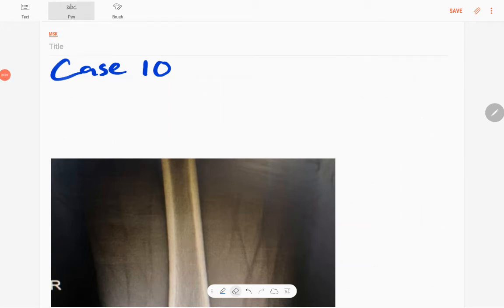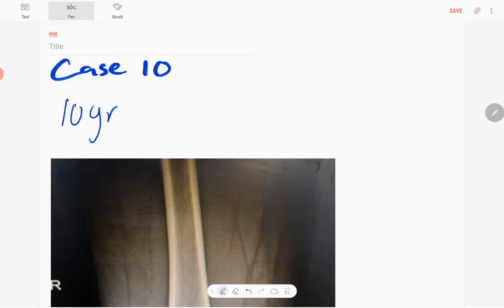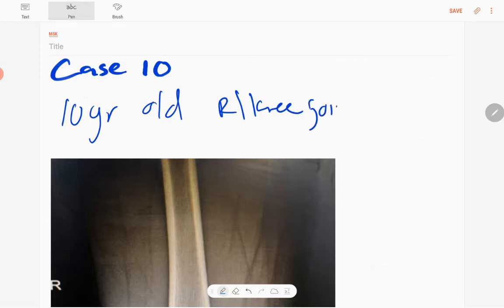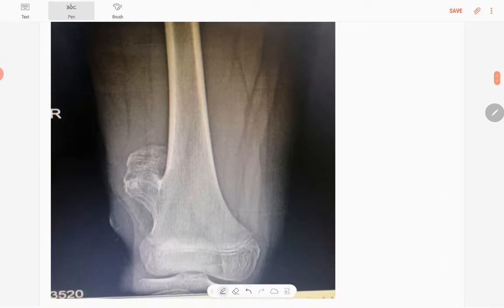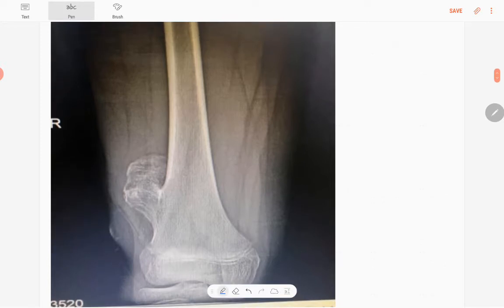Welcome back everyone. This is case number 10 of the MSK series. Today our case is a 10-year-old boy who presented with a progressively enlarging lump in the right knee joint for eight months duration. This is the anteroposterior radiograph of the distal right femur in a skeletally immature patient.